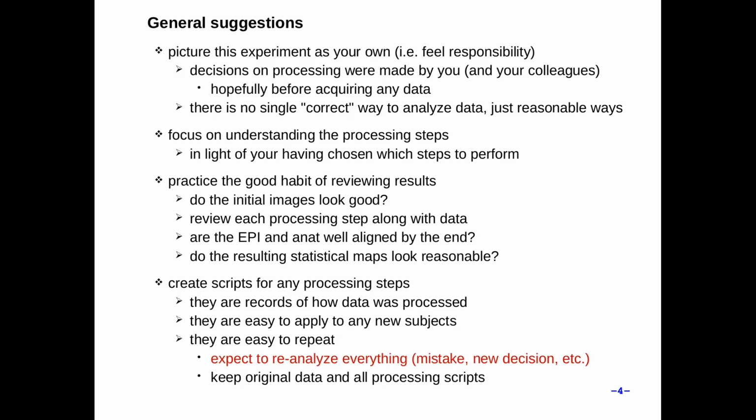But anyway, I used a GUI to do it, and I had some notes about it on some piece of paper that it was eaten by my goldfish. I'm not quite sure where it is. You don't want to be in a position like that. Just script everything.